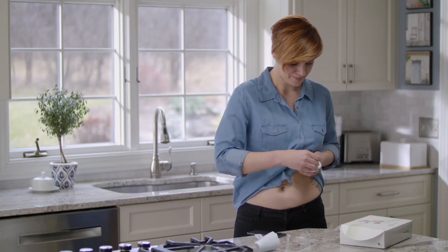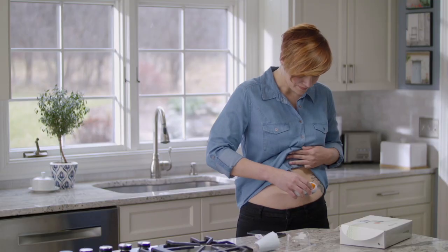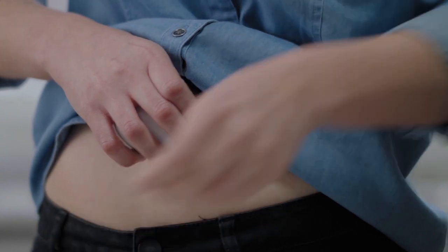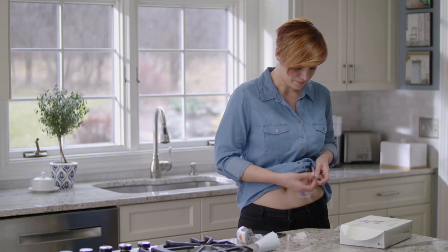Remove both labels, do not touch the adhesive. Place the applicator on your skin. Fold and break off the safety guard. Press the button to insert the sensor. Remove applicator. You've successfully inserted your sensor.